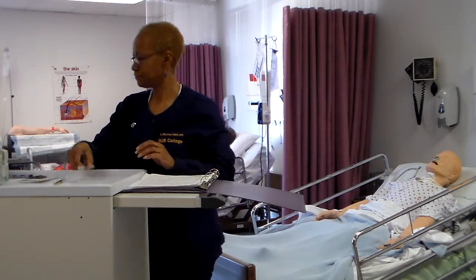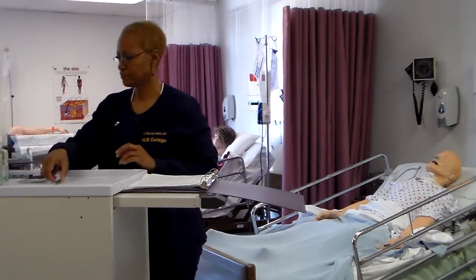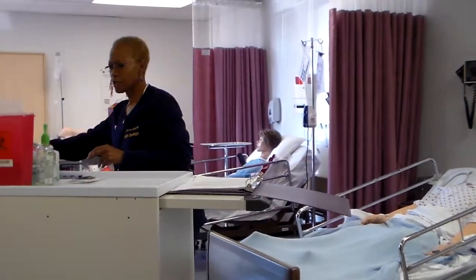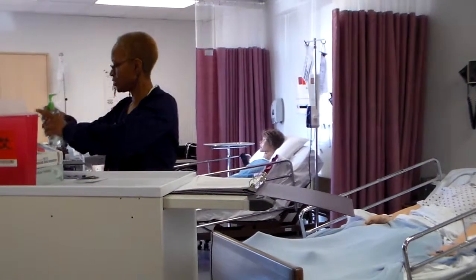Okay. Take medication to client at right time and perform standard steps. Close door, pull curtain. Okay, so we're going to make sure we prepare everything.